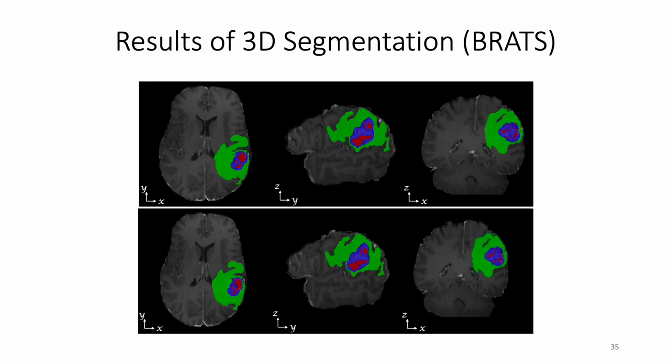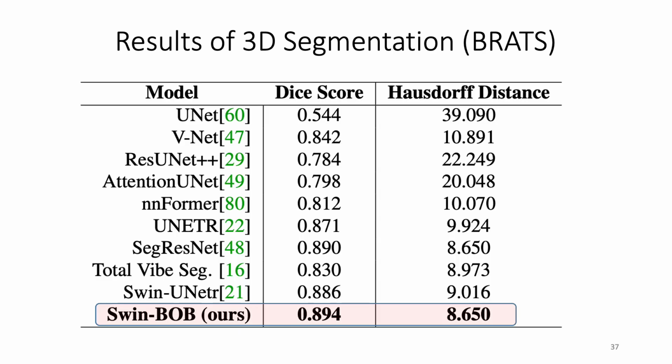And when we fine-tune and test our model on BRATS 3D tumor segmentation of the brain, our SWINBOB model also achieves state-of-the-art results with significant improvement compared to previous models.